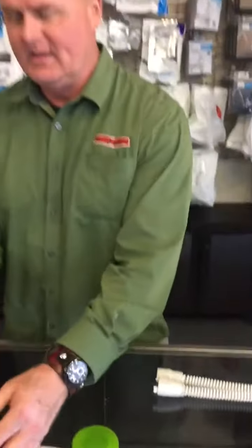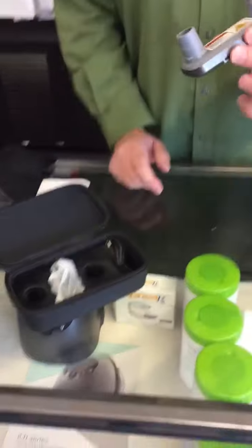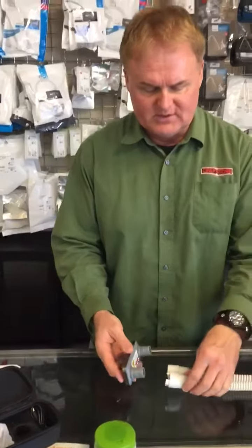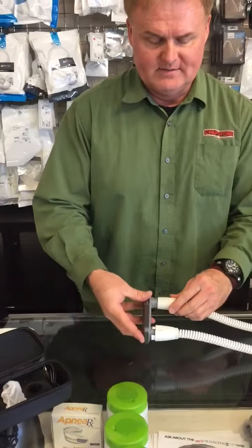It comes with a carrying case like this. It is also a chargeable device. Once it is charged, you can then use it. Basically, what you do is attach both ends of the hose that you want to sanitize to the device like this.